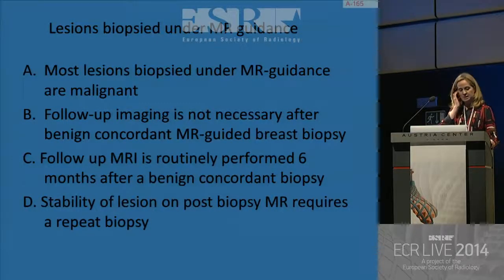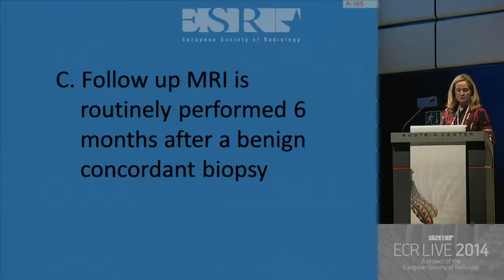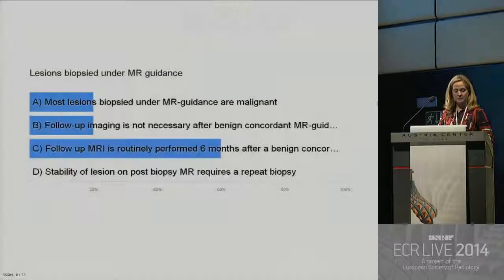So for lesions that are biopsied under MR guidance, what is the correct answer? A, most lesions biopsied under MR guidance are malignant. B, follow-up imaging is not necessary after a benign concordant MR-guided biopsy. Or C, follow-up MR is routinely performed 6 months after a benign concordant biopsy. Or D, stability of a lesion on post-biopsy MR requires a repeat biopsy. Can I have your answers, please? C. That's right. Follow-up MR is routinely performed 6 months after a benign concordant biopsy.